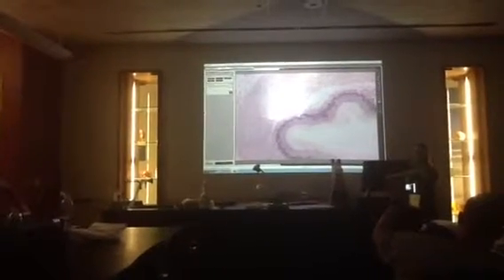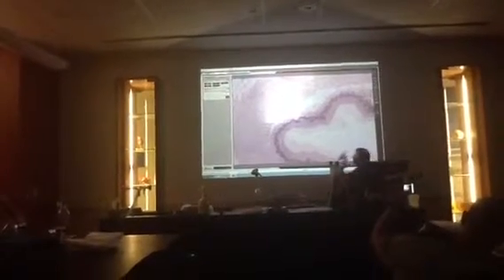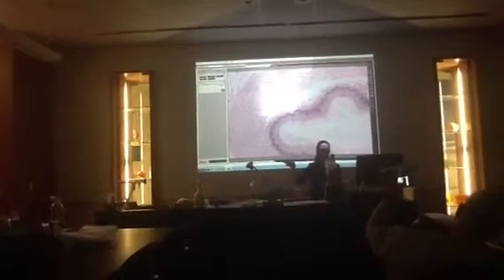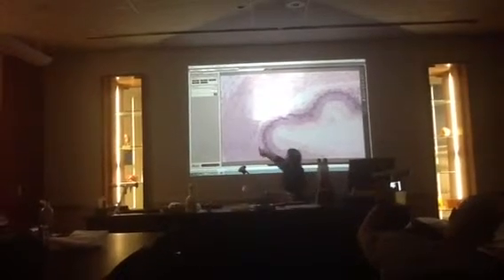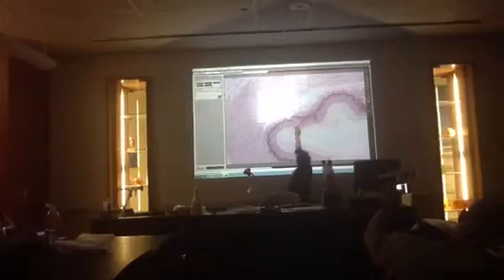To the outside of that is the submucosa. So the submucosal layer on most of these slides is going to look like absolutely nothing. You don't have to know and recognize blood vessels in it. You just have to know that that's the layer. So in here, we really see the submucosal layer starting right here and then going up that way. So again, it looks very much like nothing's in there.